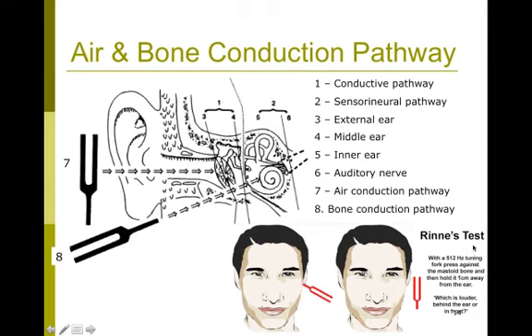The Rinne test is one of the classical tuning fork tests that was used traditionally by otolaryngologists or ENTs, or pediatricians, to determine the type of the hearing loss. Here they present the sounds through an air conduction mode, and then they present it through the bone conduction mode, often by striking the tuning fork and placing the base of the tuning fork on the person's mastoid. So when they compare the responses they get for air conduction and bone conduction testing, they'll be able to get an idea of what the type of hearing loss is.